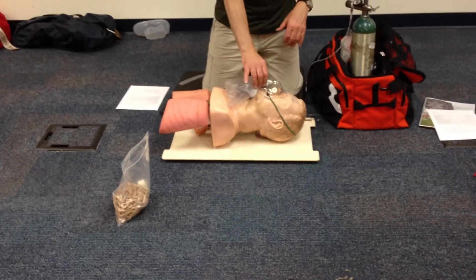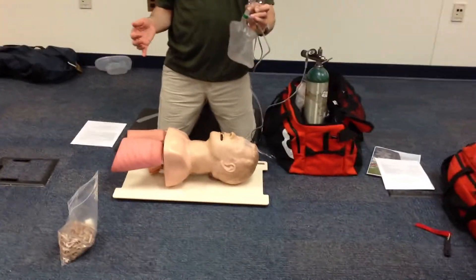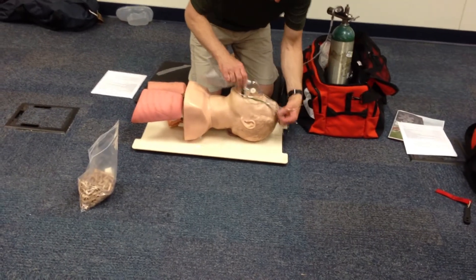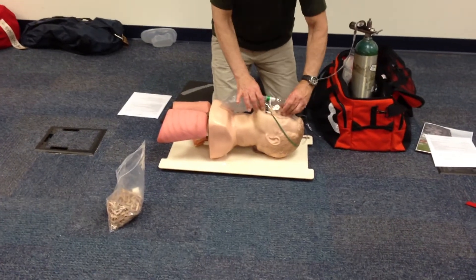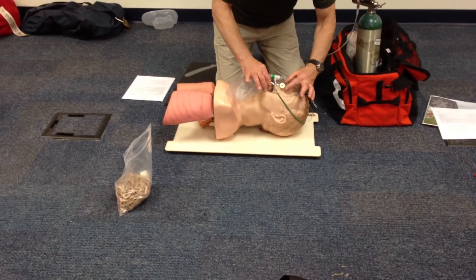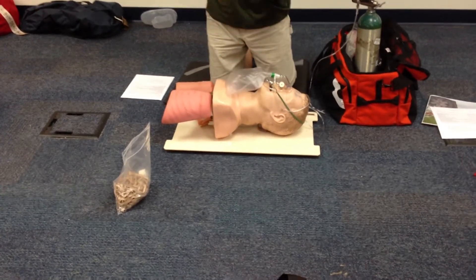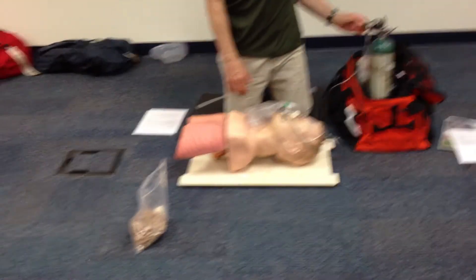To repeat the sequence: start at 10 liters per minute, pre-fill the reservoir bag, then reassure the patient — 'Sir, this is oxygen, it's going to help you' — and apply the mask with a good seal, pinching at the nose. Try to breathe normally. If with the patient's breathing the bag starts collapsing, go up to 12 or 15 liters per minute.